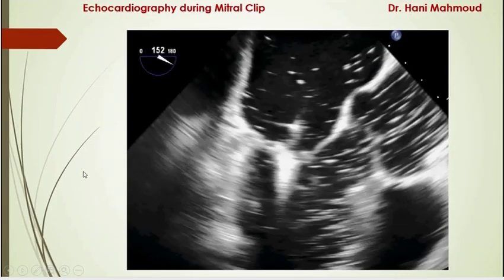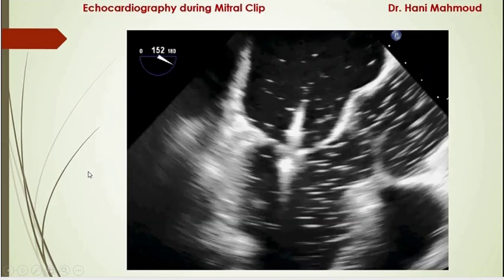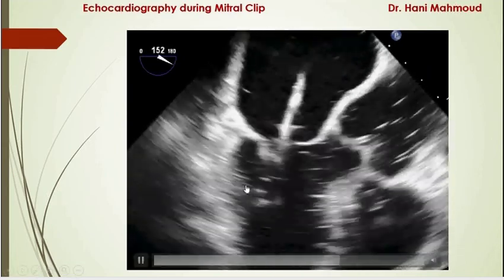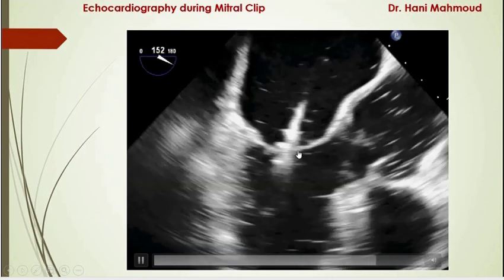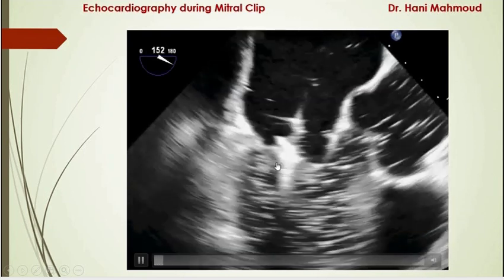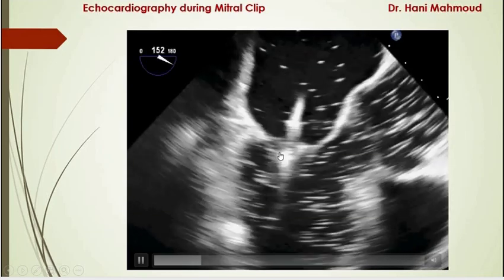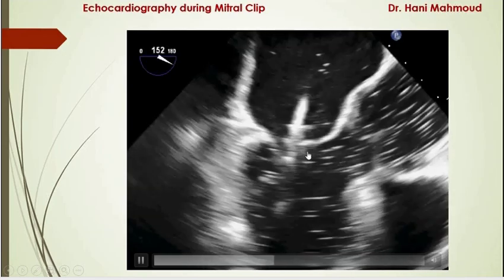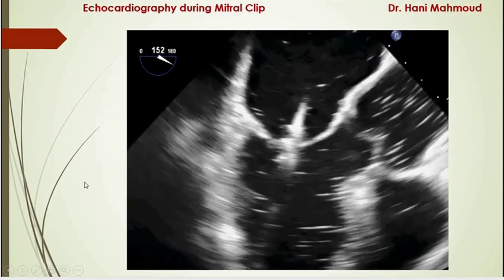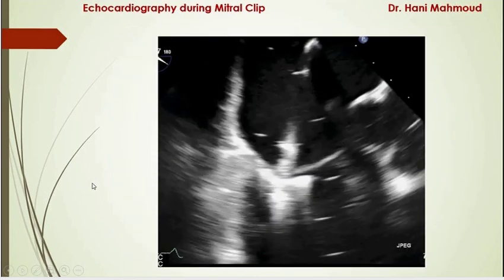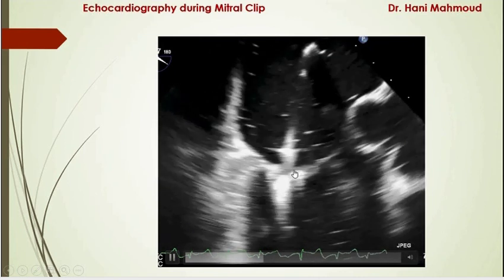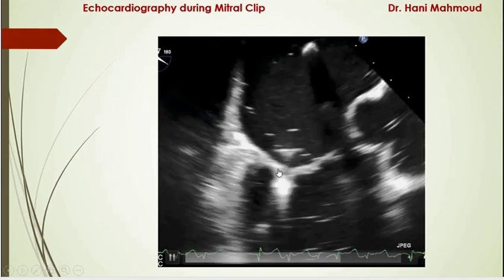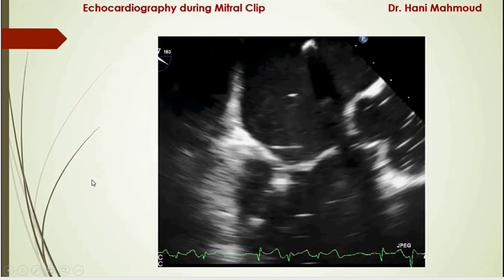Now comes the grasping moment — this is very important and everybody will be watching your screen. In the first trial, we grasped the anterior leaflet but the posterior leaflet came out of the clip. The grippers came down and the arms came up: anterior leaflet was taken but the posterior leaflet was lost. We tried another trial: grippers down, arms up, anterior leaflet in, posterior leaflet in. This was successful grasping.